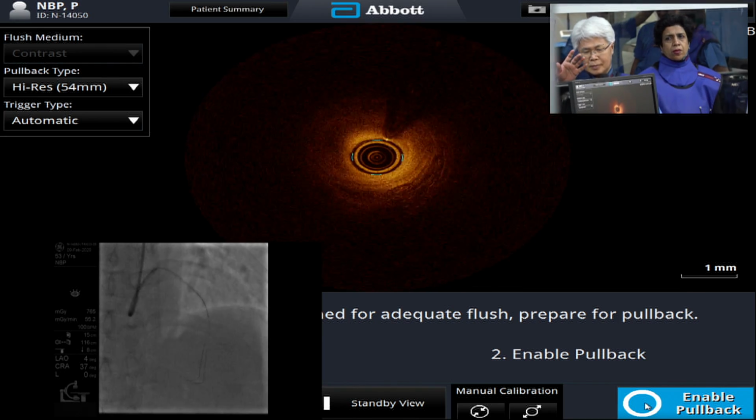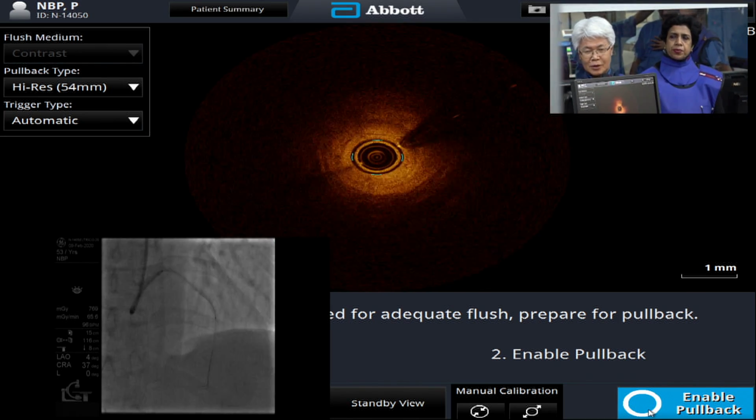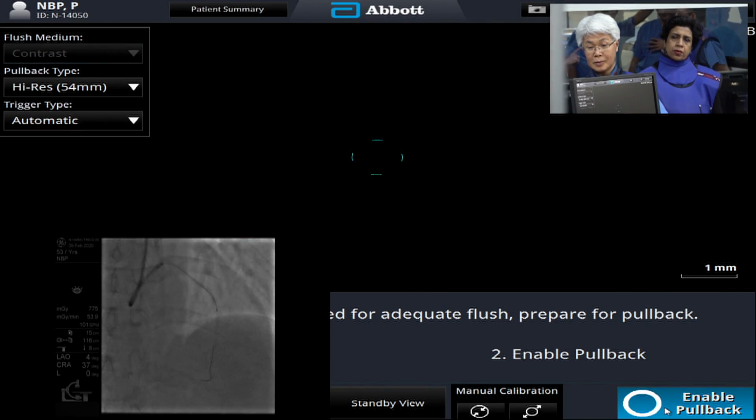Distal wire is okay. Wait a moment. We are now just focusing on the OCT detection. I will answer later. Yes, ready?